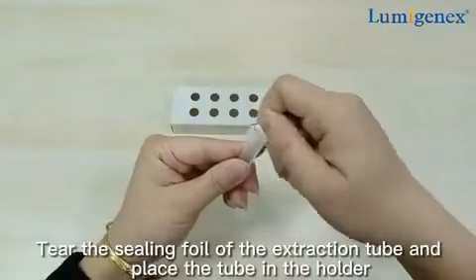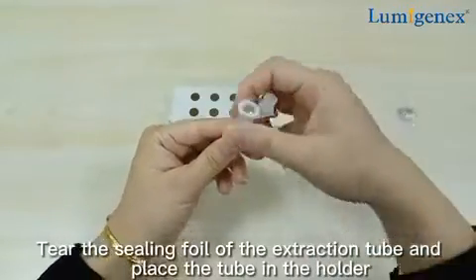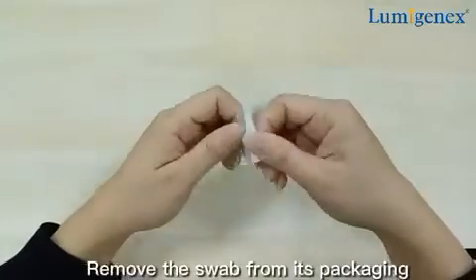Tear the sealing foil of the extraction tube and place the tube in the holder. Remove the swab from its packaging.